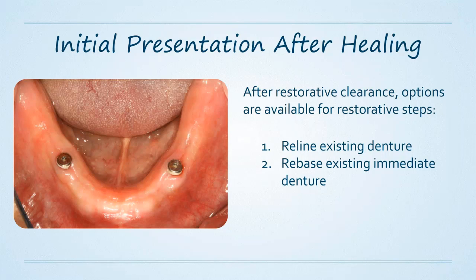If the patient is wearing their existing complete denture, maybe the patient came in and said, "Hey doc, I've got some money, and I was really thinking I want to put it into just helping me feel a little bit better with my lower denture. It's kind of flopping around. I think now's the time. I've been hearing about these implants." No problem. They're wearing their regular denture that they've been wearing for 20 years.